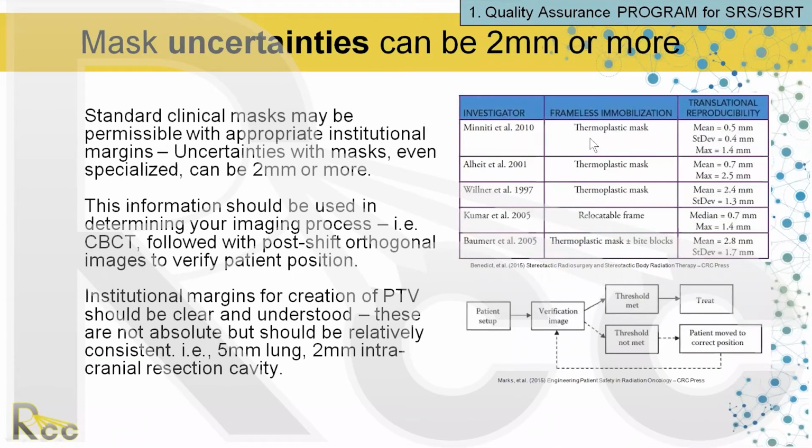And there, you can look for these studies, and if you want to replicate them yourself, or you can use these ones that are specific to your system. But no, I'm not gonna go into the specifics of measuring uncertainty for a mask.